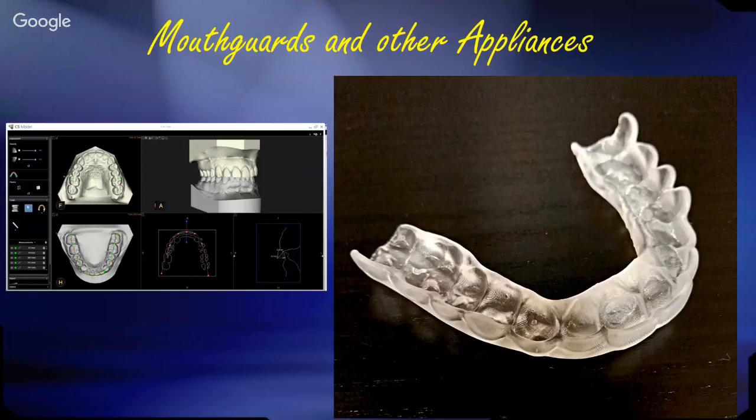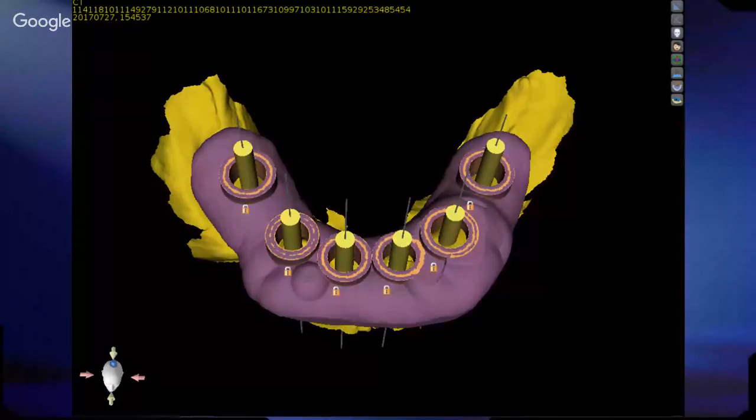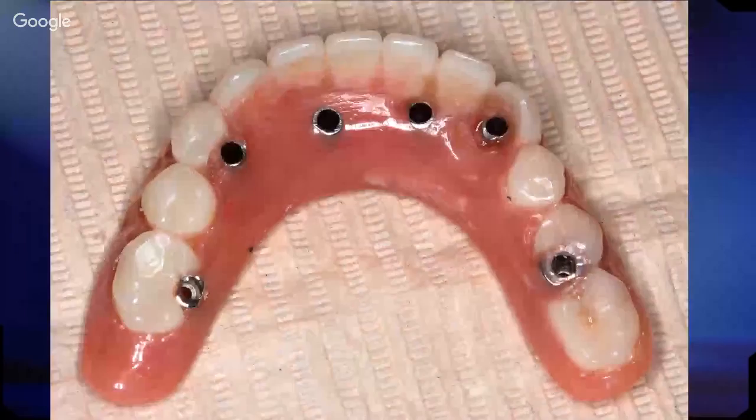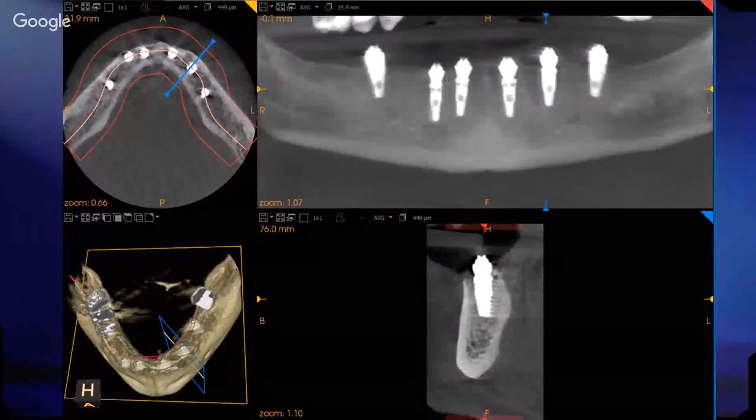So other things we're doing, sorry, go ahead. What torque values do you expect when doing a guided technique like the case where you use the two sequential guides? So it's going to be no different than if you were using a bone reduction guide. You're going down, in this particular case, into the basal bone. So you expect that you're going to get good torque values. Our torque values are typically in the high 70s. In the maxilla, sometimes not so much.